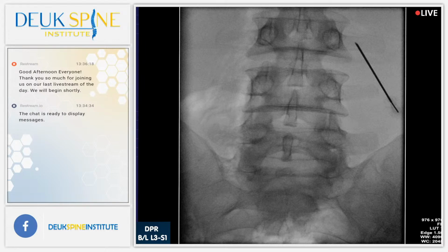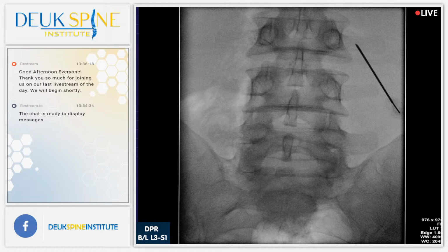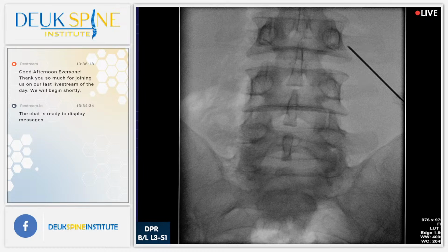So I need to get more medial. It's better. Right about there should be good. Let's see.